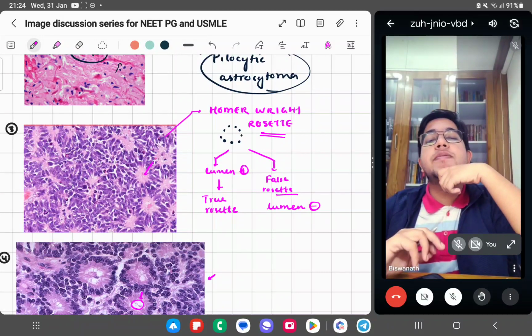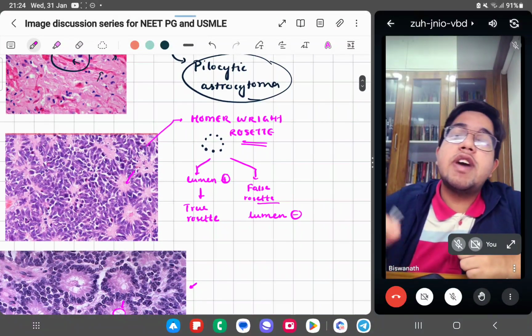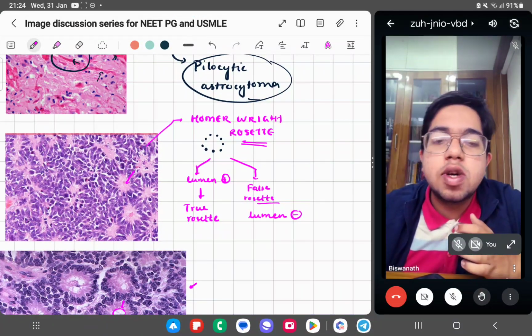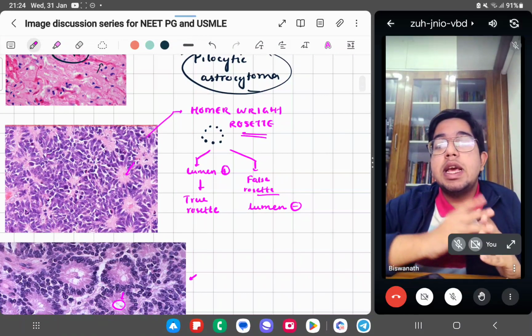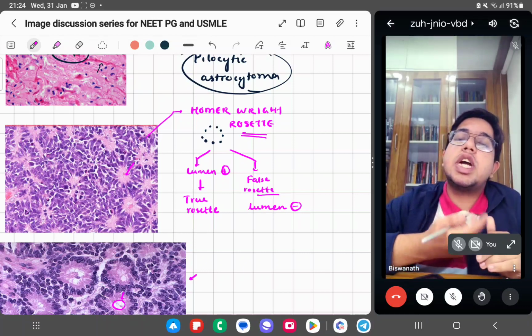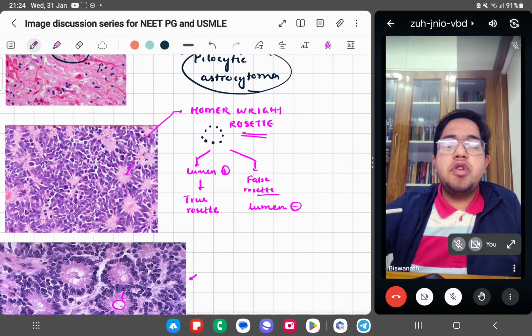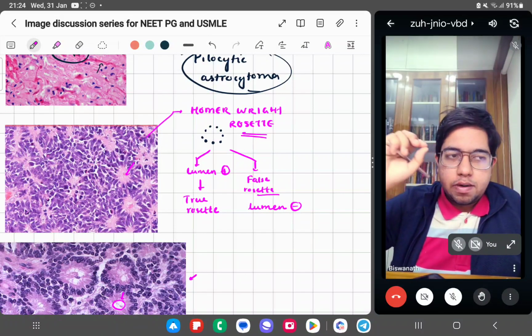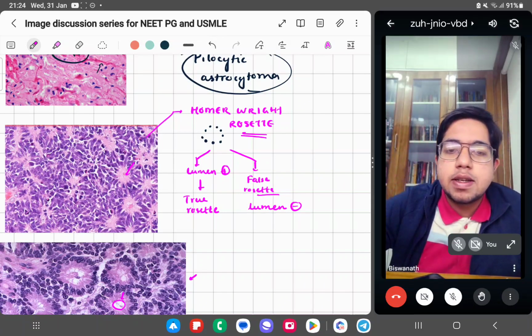Can you just say? Yeah. This is neuroblastoma, which you must have read. I'm sure you have read it in your childhood tumors. Neuroblastoma. Don't skip these chapters like environmental pathology and childhood tumors, and there are plenty of things in disorders of infancy and childhood. If you know about Wilms tumor, if you know about some other peripheral things, it's more than enough.